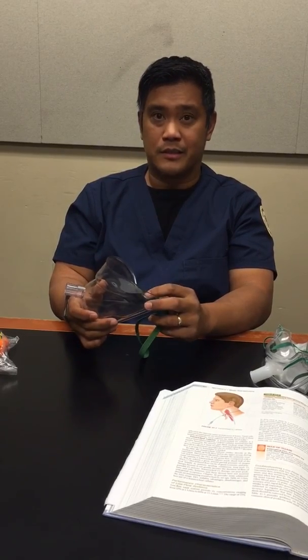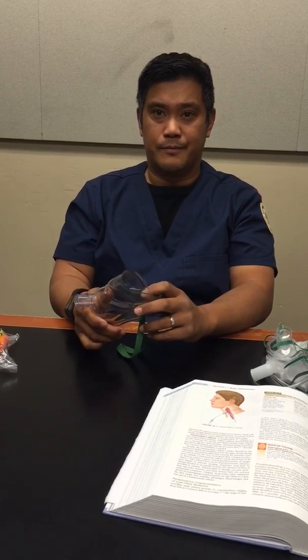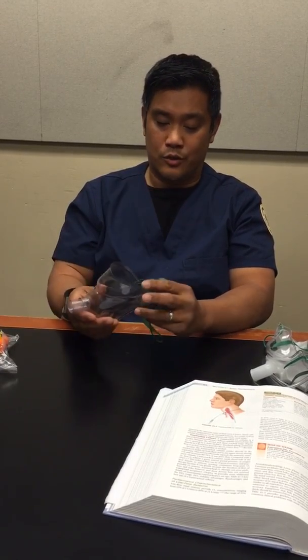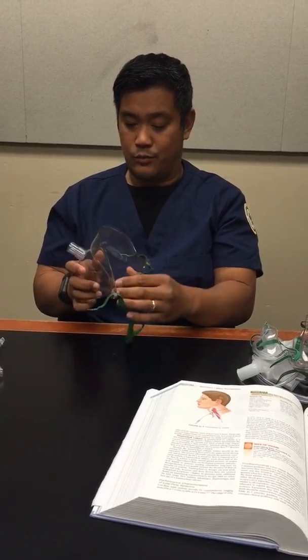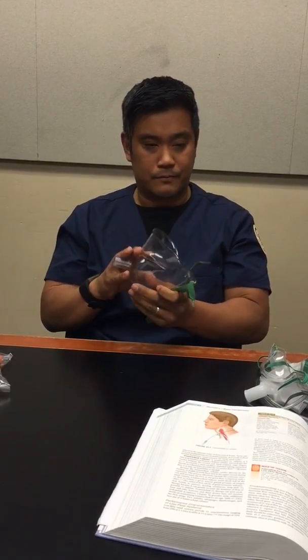This device is best used for patients with intact upper airway, but who have burns around their oral area, and you don't want it to be in contact with anything. So essentially it would be against the chin like this and somewhat away from the face, and that's where the flow and the oxygen will go to the patient.